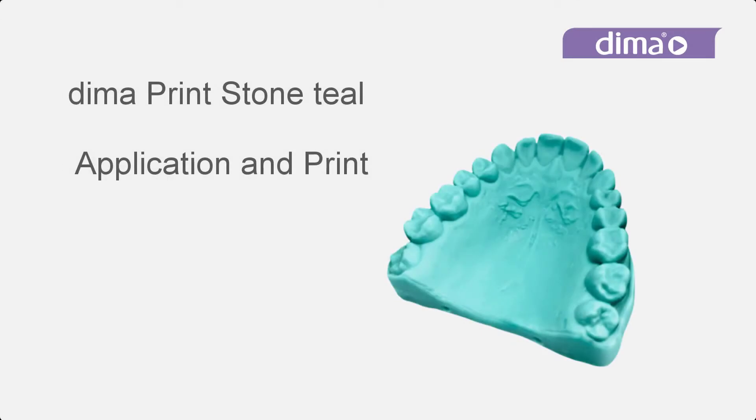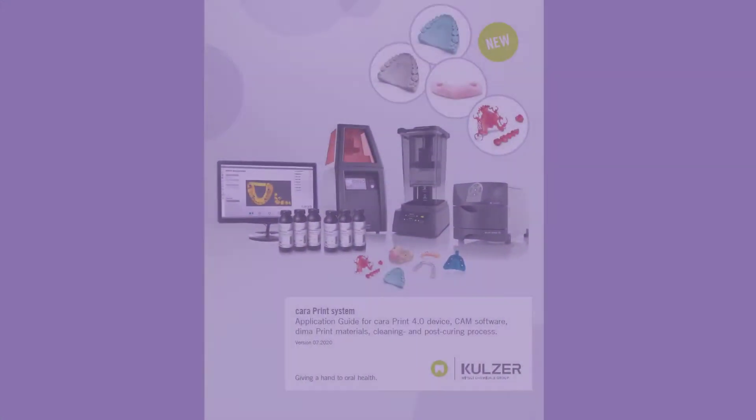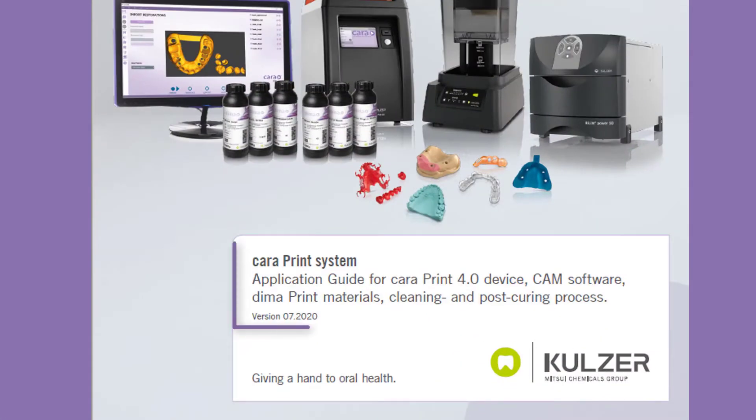This video shows the application of dima Print Stone teal for printing a model for a splint. During construction in your CAD software, please pay attention to the minimum thickness and the necessary diameters of the drain holes on the basal and lateral surface. You can find these for each dima Print material in our application guide.